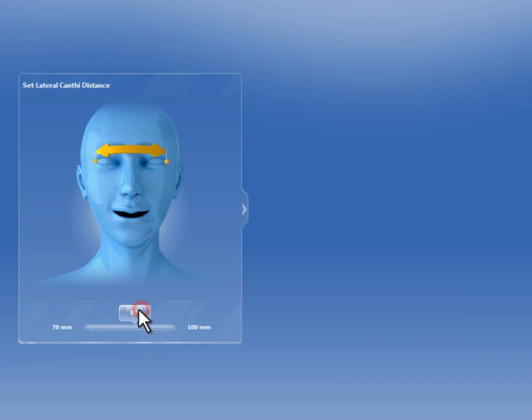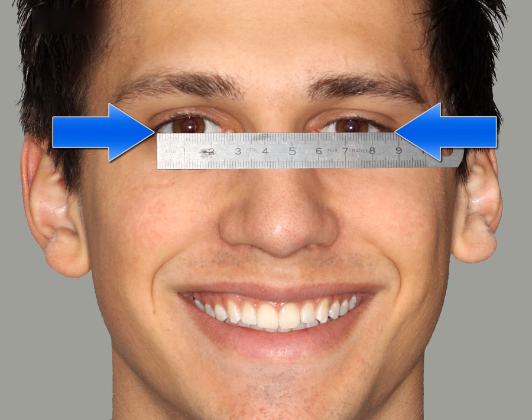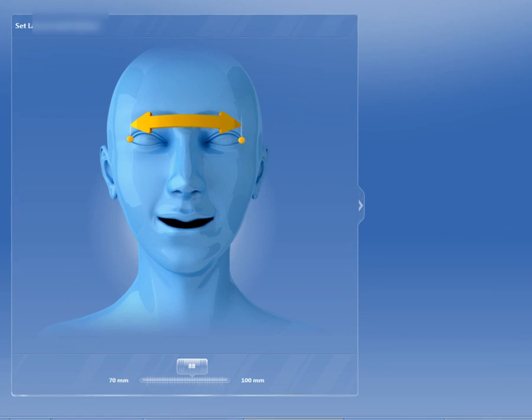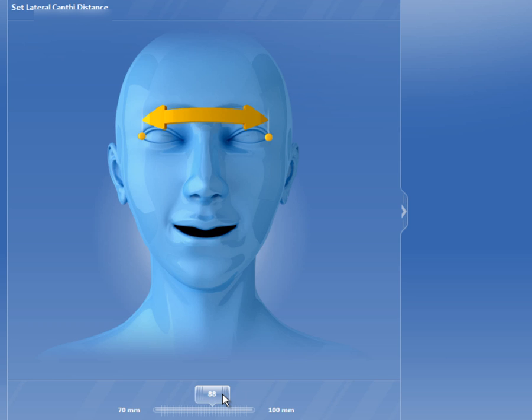The distance between the eyes is measured — specifically the distance from the outer corner of the left eye to the outer corner of the right eye — and the result is then entered in the software. The magnification scale is then measured based on this to scale the model to the portrait.